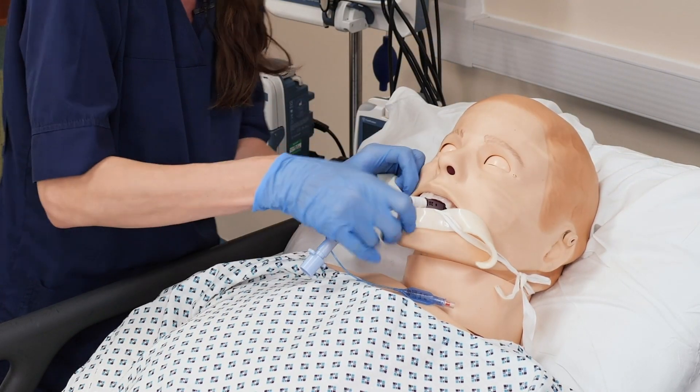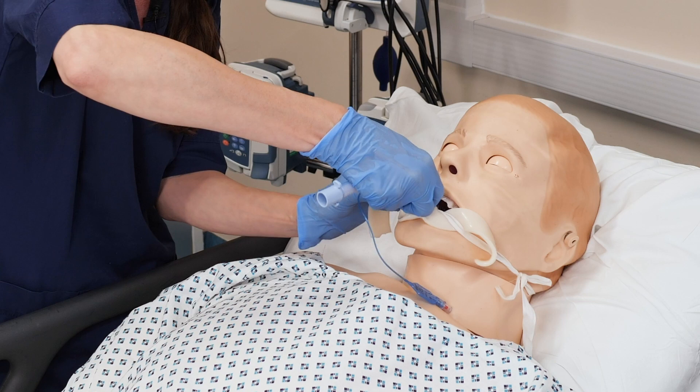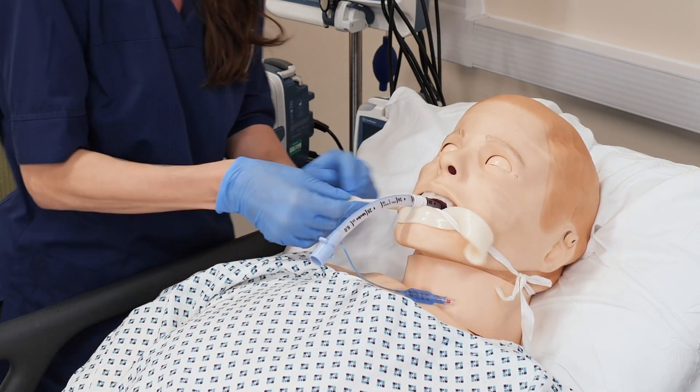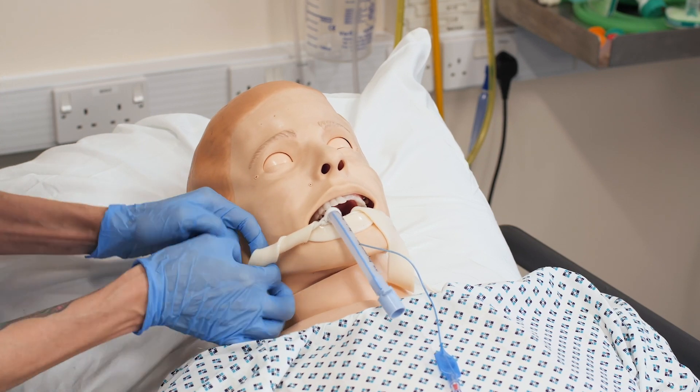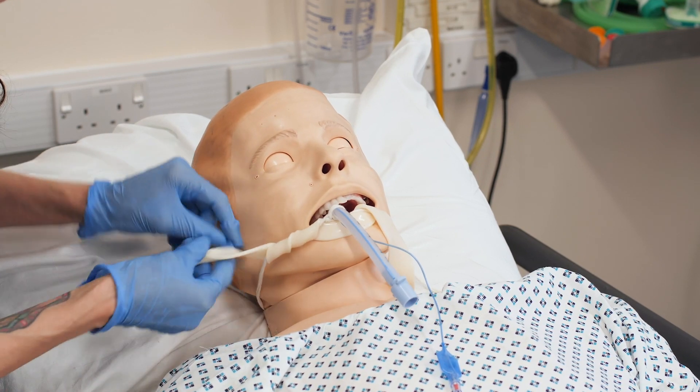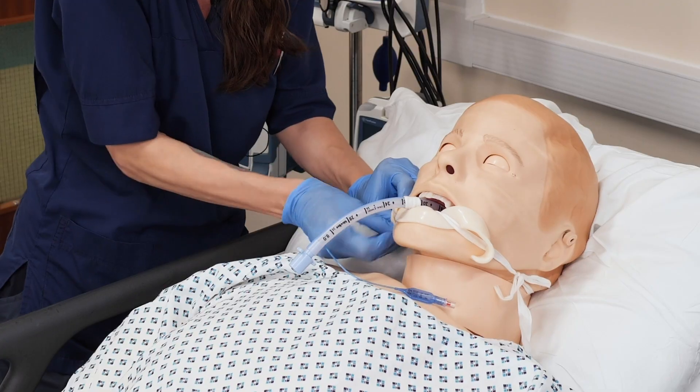Just pull it tight enough so that it is resting there on the lip, and then you're going to twist it right around the tube so that all areas are covered and it's not touching the patient's lips or their face as well.